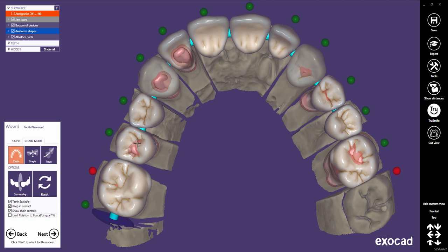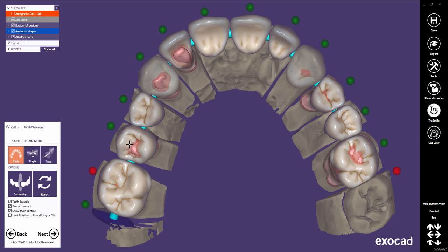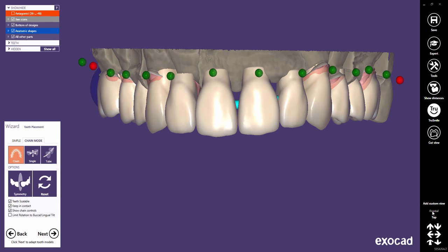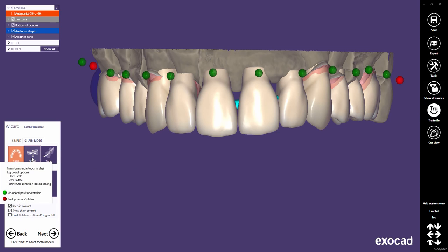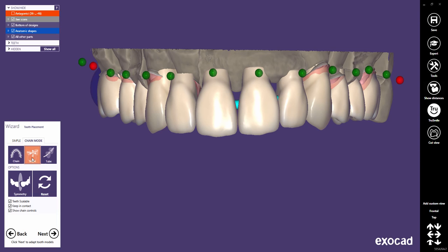All other rotation directions do not influence the tilt of adjacent teeth directly — only their positions are affected, as they remain in contact with the tooth you rotate. Let us now switch to the single mode.